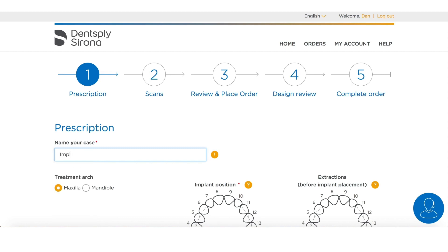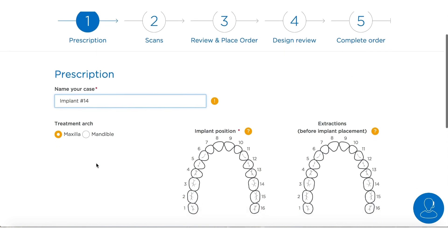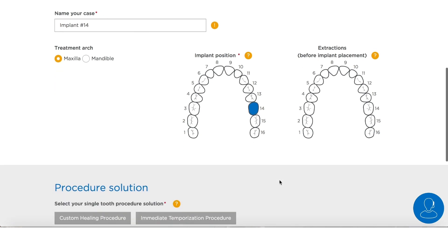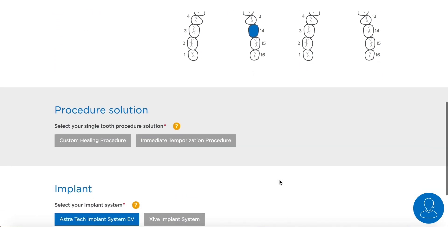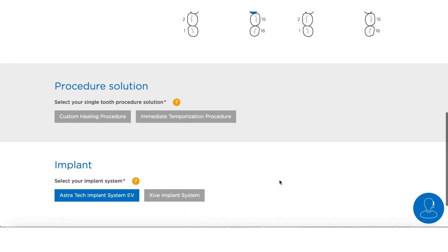First, we're just going to choose the name for the case — it can be anything you like. We're going to choose whether we're placing the implant on the mandible or the maxilla, we're going to select the position for our implant, and if we're going to be doing an extraction and an immediate implant placement we would click on that.